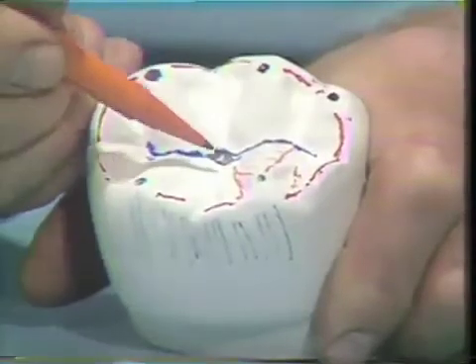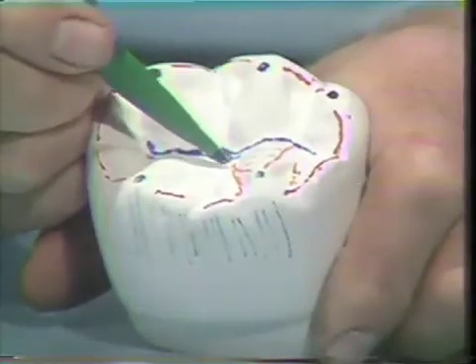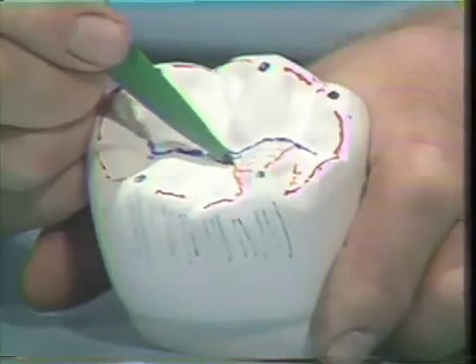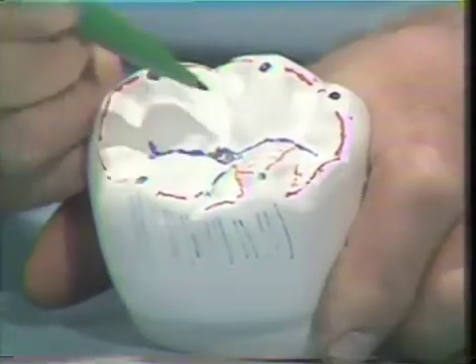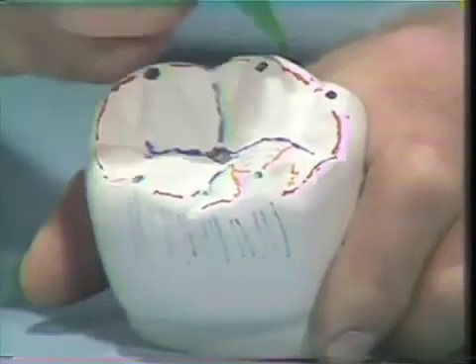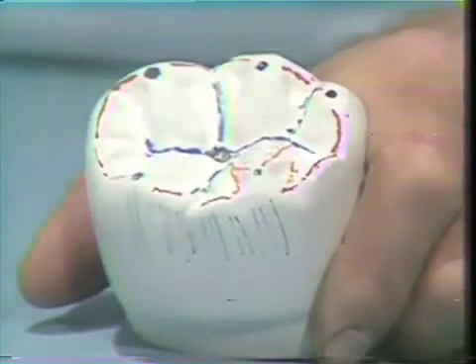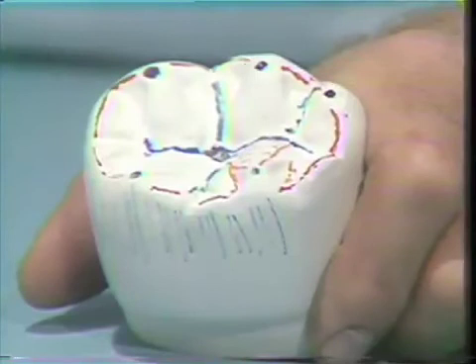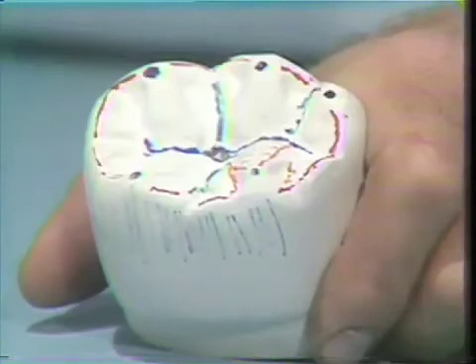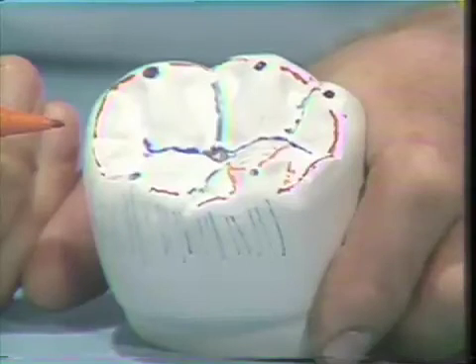And then further we have the sluiceways, which allow the teeth to pass across one another without interfering. Here we have a developmental groove or escape way for the opposing cusp, similarly here, and similarly in this area on the buccal surface. This completes the occlusal morphology of the tooth. The height and position may be dictated by function, but it also may be dictated by the ideal morphology of the tooth if it's a non-functional portion of the surface.